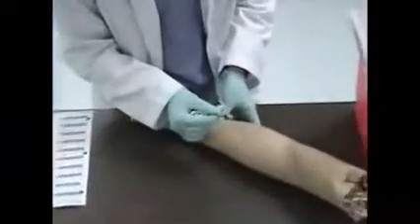Before I give this injection, it is important when you're giving an intradermal injection that the bevel, or the tip of the needle, be facing up so that once the medication is administered, you will have a bubble, or a wheal, under the skin. The angle for this injection is 5 to 15 degrees. That will ensure that the medication goes in the dermal layer of the skin.